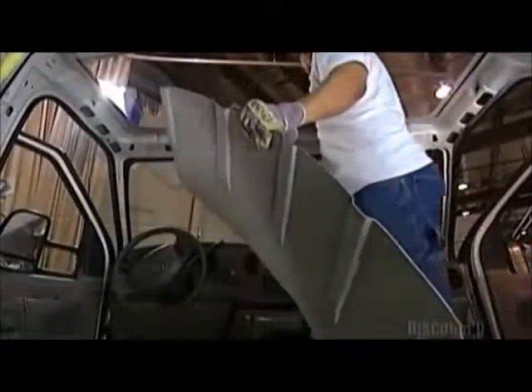Workers begin by cutting a hole in the roof. This allows them to install a raised aerodynamic roof. The angle of the new roof lessens air resistance, enabling the ambulance to run more efficiently with more control.